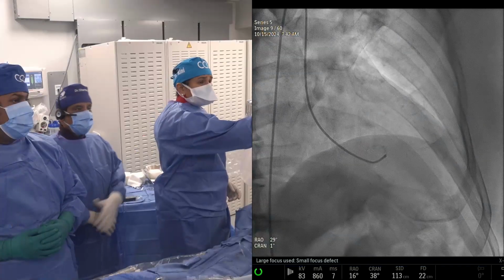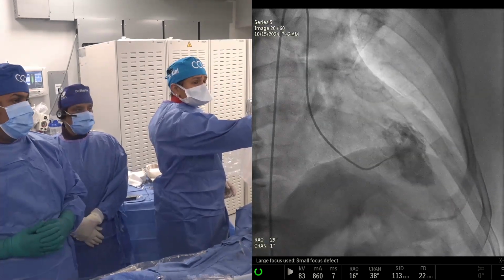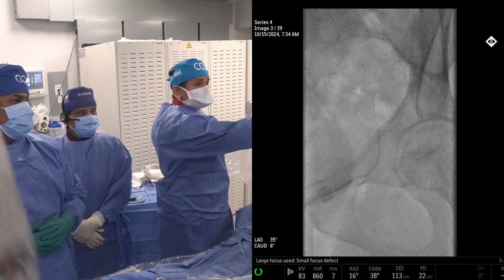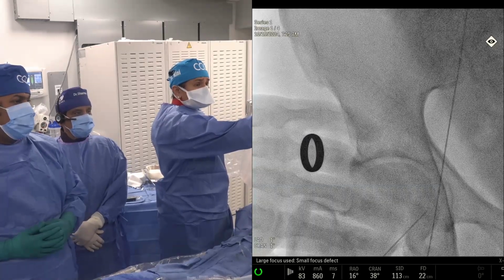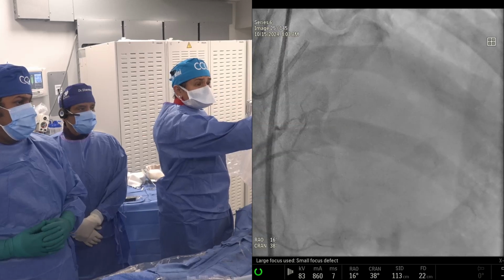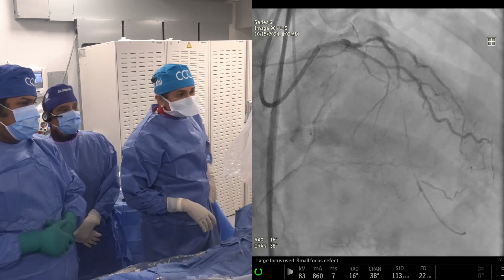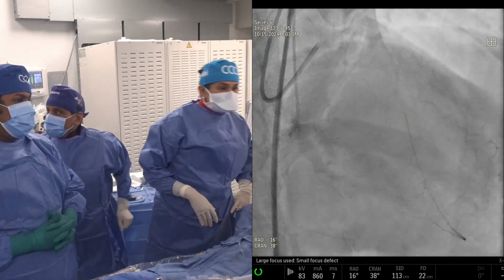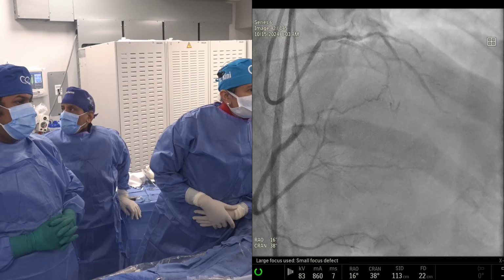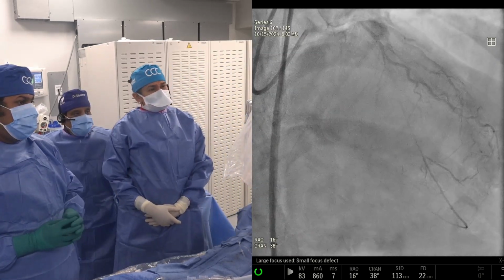LV, show this. LV was normal. Yes, normal EF, and this is the right coronary artery. Previous PCI there. No RCA injection. Oh, we didn't do. Okay, all right, so the RCA looks good. The injection is there, but look at the LAD complexity: calcium, long segment, and bifurcation. And you tell us what your strategy will be, where you think the stump is.